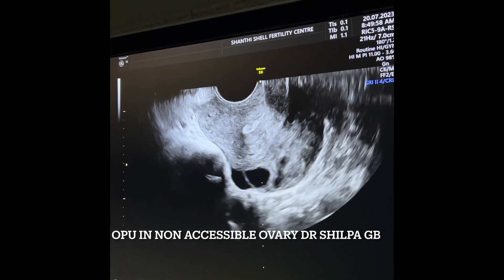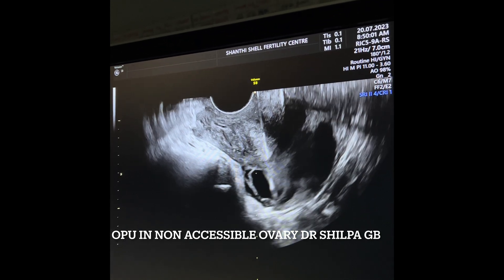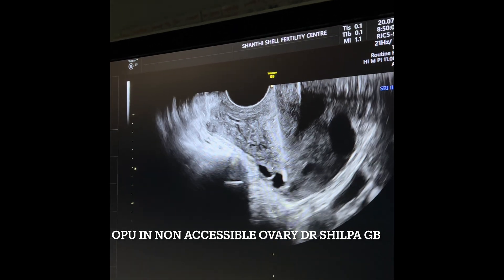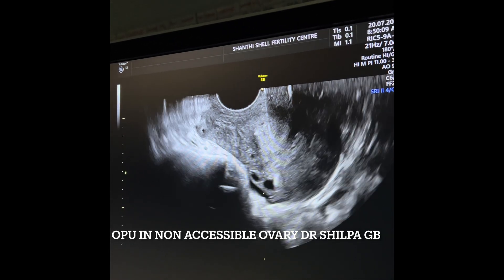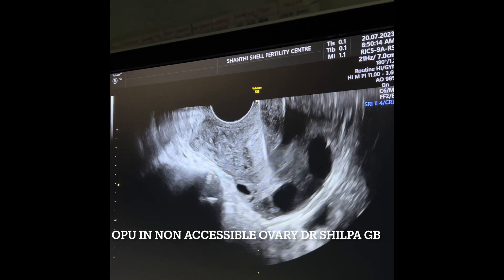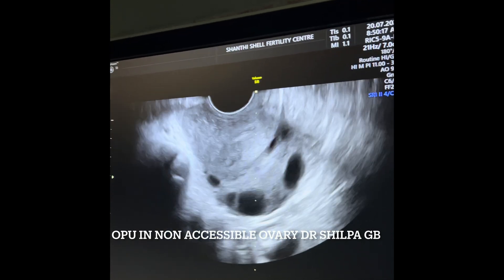I used the Doppler before making the entry to check if there are any big vessels on the line, and there was nothing. Here I have just turned the probe a little and I am aspirating another follicle. In these cases we have to be careful — we shouldn't poke too many times; finish it all in one prick.